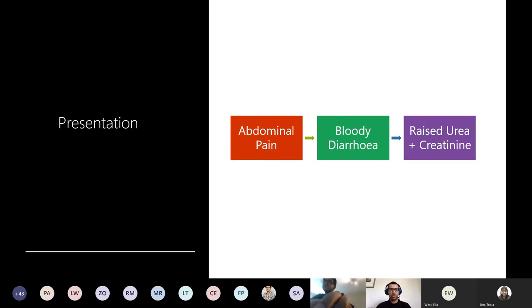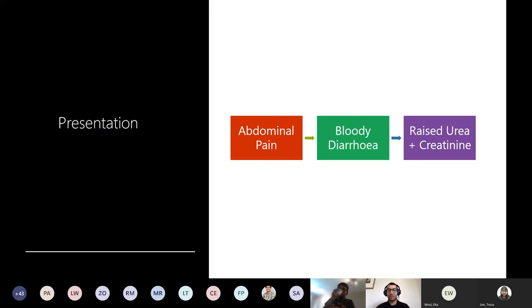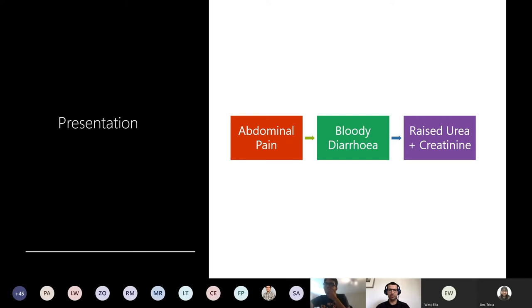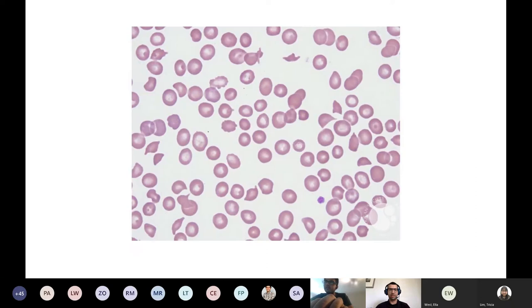Okay, this is the first presentation - as I said, very short. I haven't even told you the age or gender, but someone has abdominal pain, they have bloody diarrhea, and have raised urea and creatinine. Take that in, and then here is their blood film. I'll give you a second to look at that before moving on.